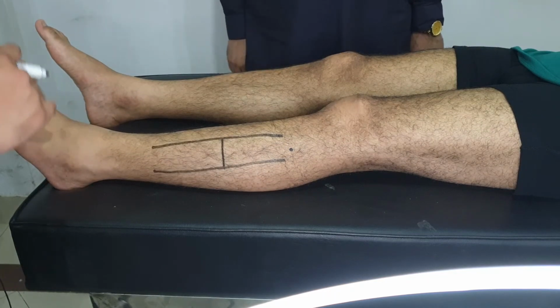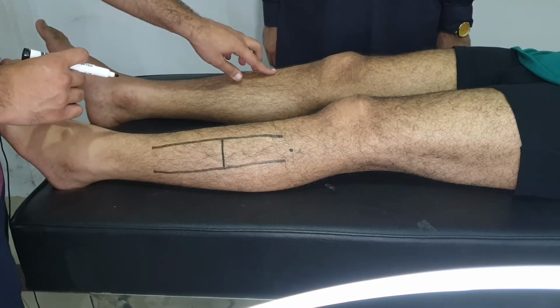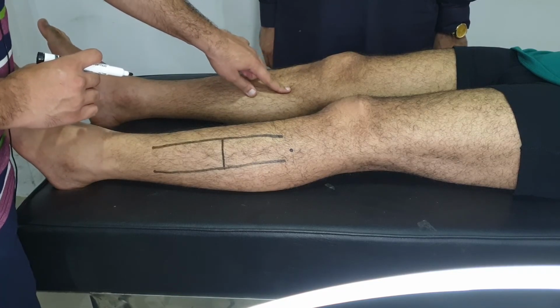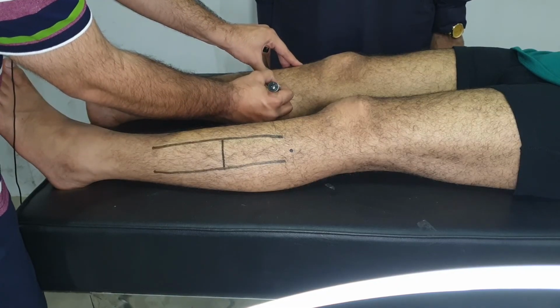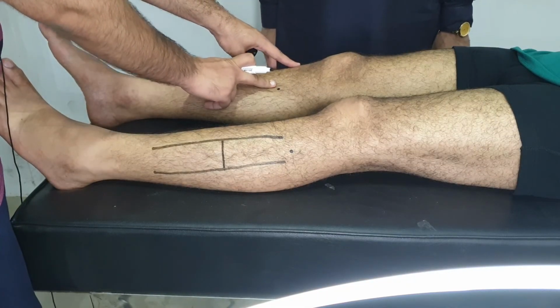How will you give the incision on the medial side? Yes sir. Sir, on the medial side we will give the incision 2 cm posterior to the medial border of the shin. And again the proximal landmark is 3 centimeter below the tibial tuberosity. So, this is the tibial tuberosity and this is almost 3 centimeter below the tibial tuberosity, 2 centimeter posterior to the medial border of the shin.